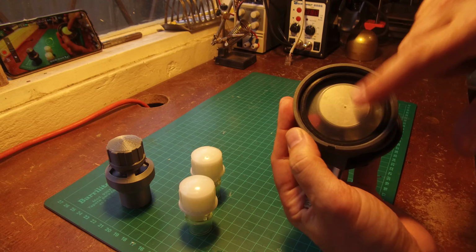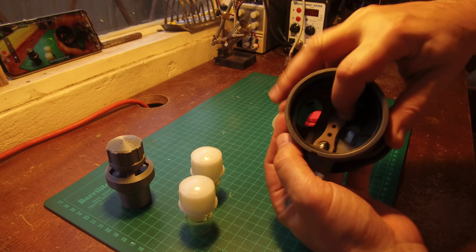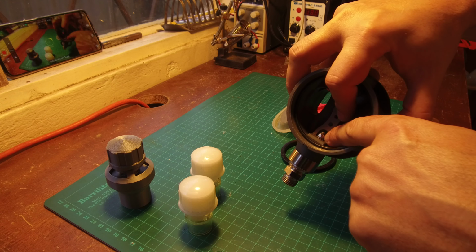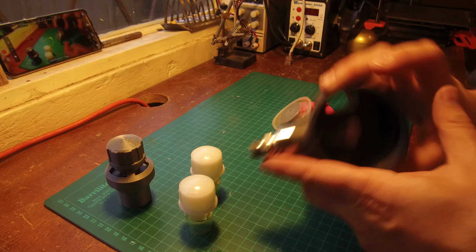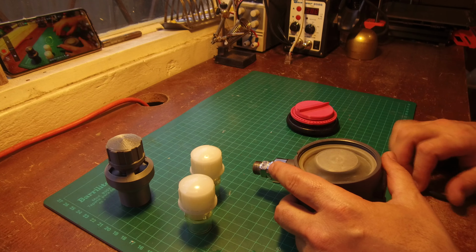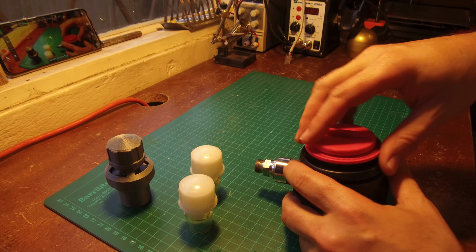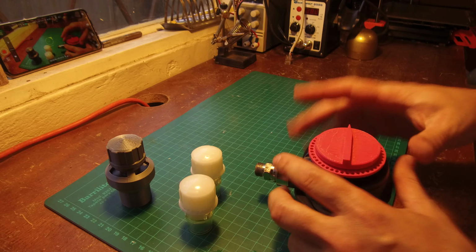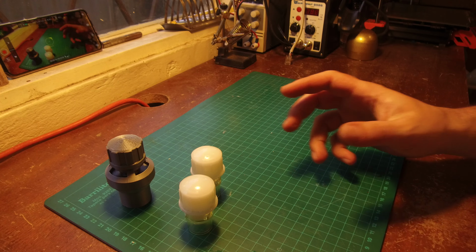Scuba diving gear, basically this works this way: you breathe in through this hole. When you breathe in, this membrane goes down. This membrane will pull a lever that will in itself open a small valve, and the pressure will go inside here and through this hole into your airways. This is how it works. The pink thing it has on the cover is just like a big screw that I made, so I can put some pressure on the membrane and I have a constant flow rate. That can be useful for doctors.